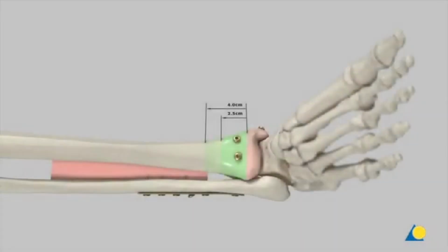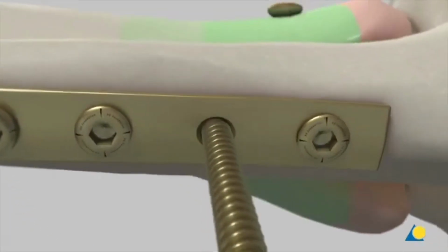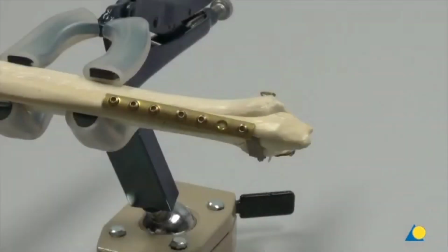The screw should be inserted 2.5 to 4 centimeters above the anterior syndesmosis. The screw must be inserted at a 30-degree angle from the dorsal direction and parallel to the tibial plafond. Ensure that the syndesmosis has been reduced properly. A K-wire or pointed reduction clamps can be used for this.